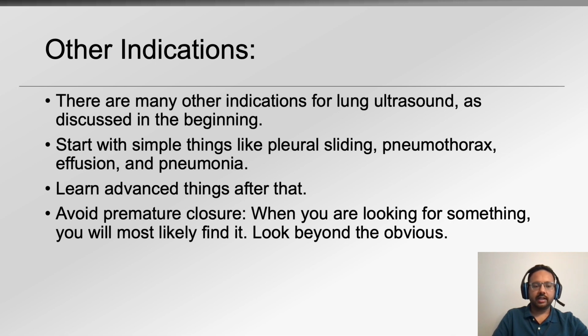And then lastly, some of the other indications, like I said in the beginning, this is not a presentation that covers everything. It covers the simple and the intermediate complexity things like pleural sliding, pneumothorax, effusion, etc. Start with those in your practice and learn advanced things after that.